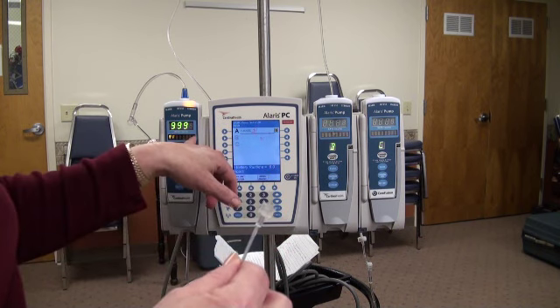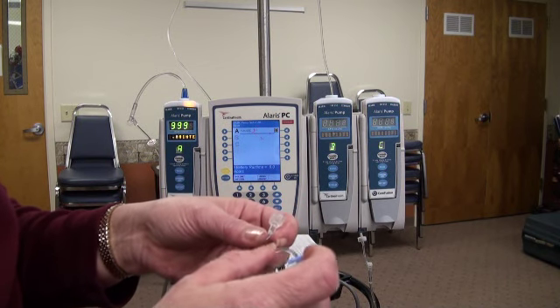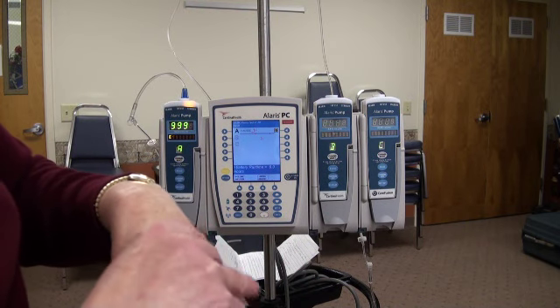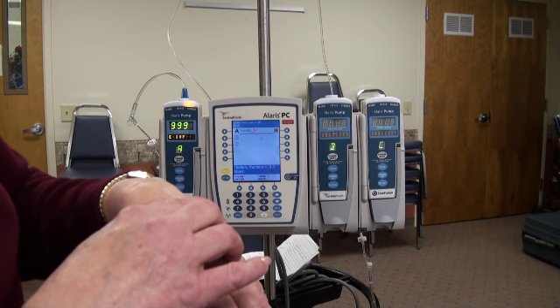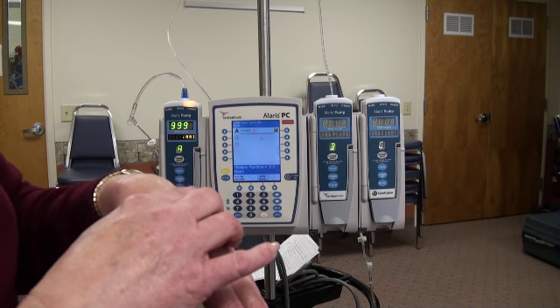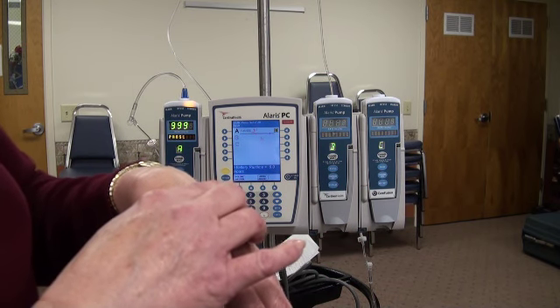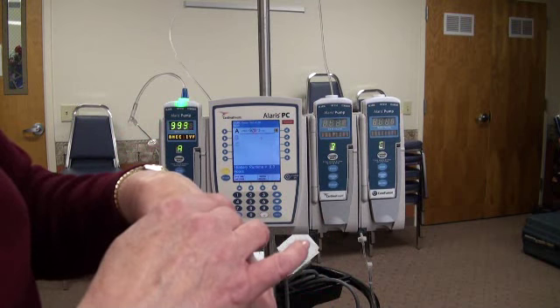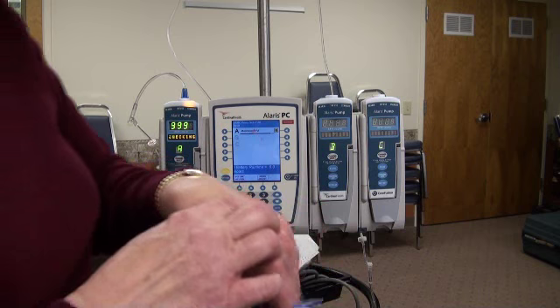At this time, if you happen to see this, you might want to go up and just start looking right away. See what's wrong. Remember, the patient's IV is right here. We have it in the hand. Always read your screen. It's going to tell you right on the screen what the problem is. It keeps saying it's checking the line while we know something's not right.